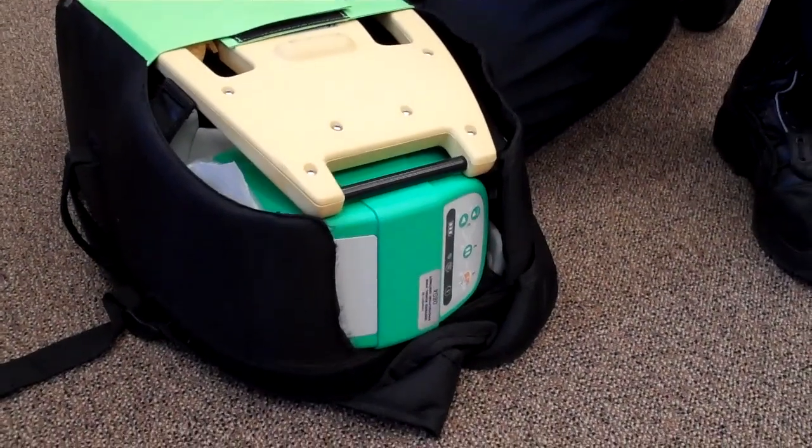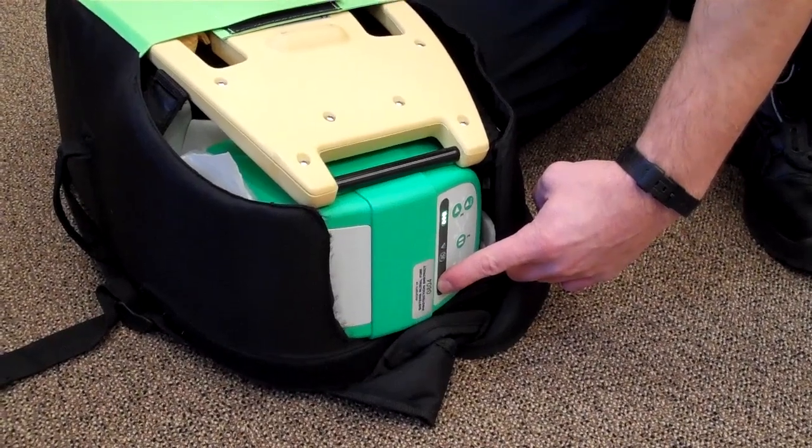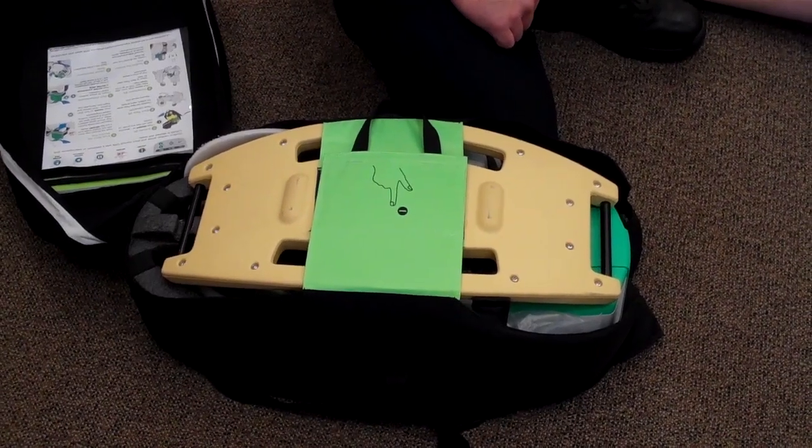Step 2. Turn the machine on while you're getting the backboard ready. Step 3. Remove the backboard by pulling on the Velcro and place it under the patient.